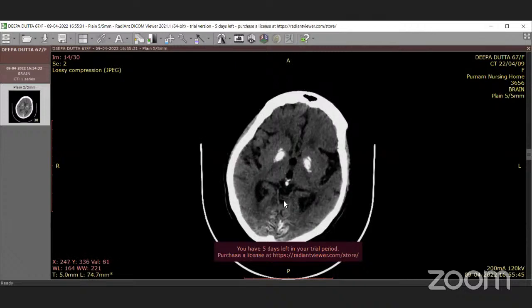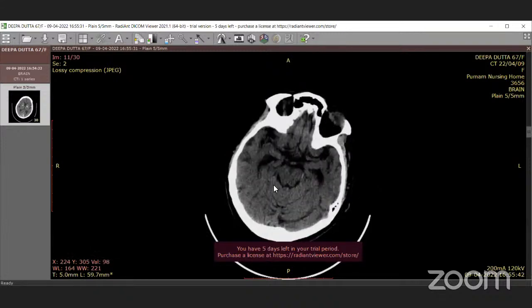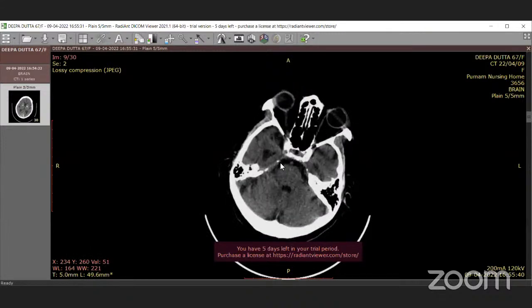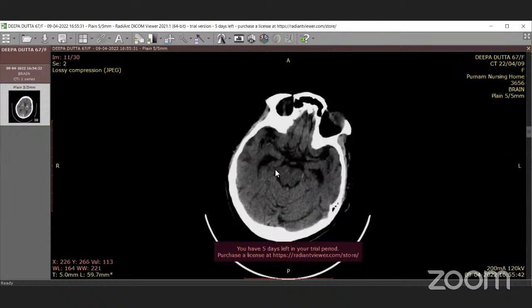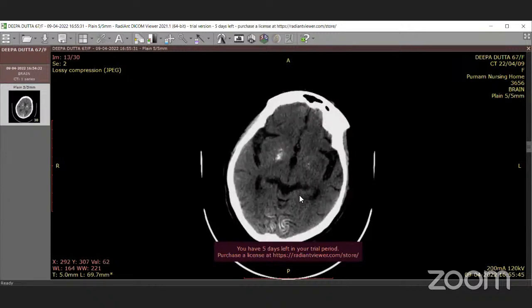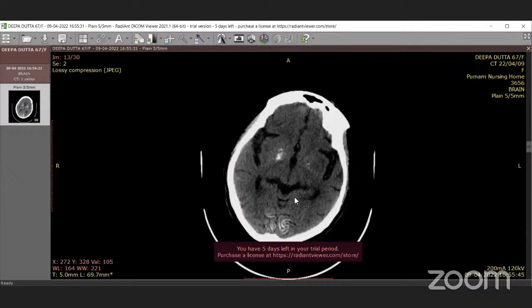At areas where the folds of the tentorium are aligned along the imaging data plane, we get more opacity, and at areas where it is more oblique, we don't see it much on the axial images. It is just how much tissue it has in that data plane that makes it visible or invisible. But we can delineate. Is it possible to show us the cranial and caudal part of it?